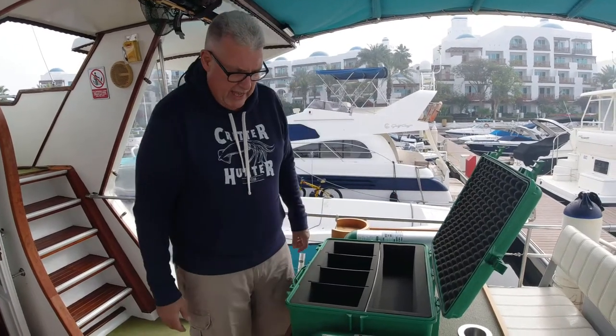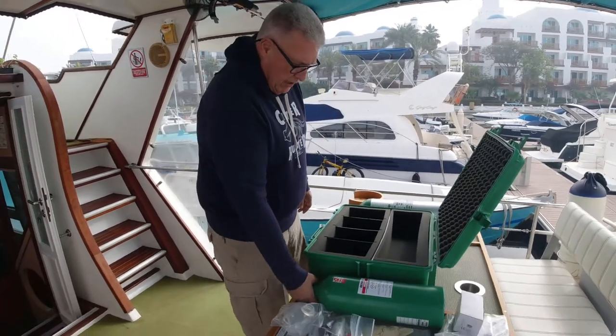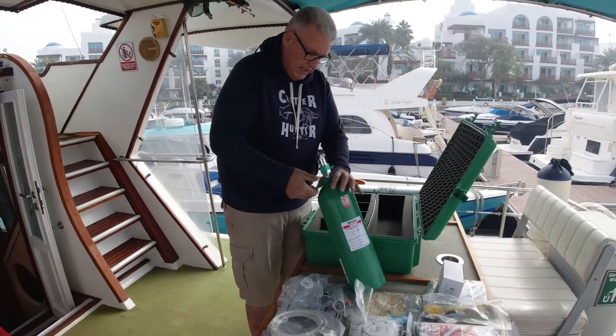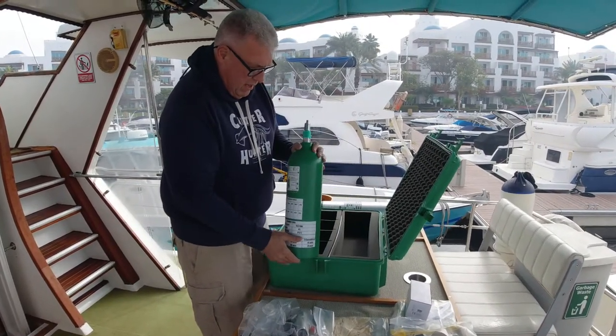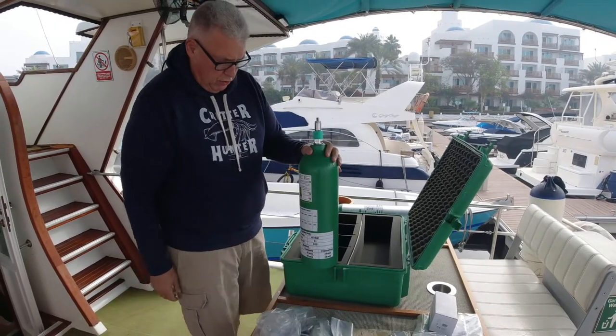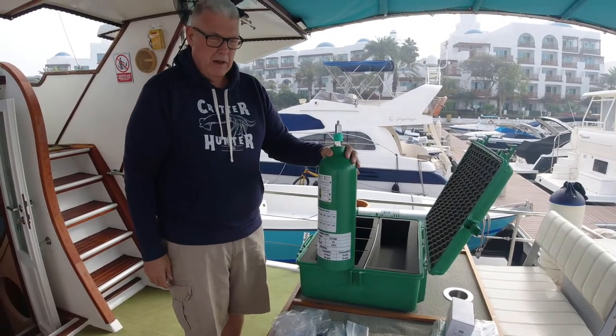There's a seal we'll change at the end, but I just want to go through what we've done to the cylinder. You saw in part two how we refurbished the cylinder, and I said I'd talk more about it in part three.